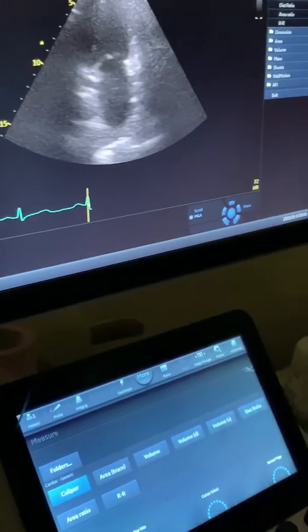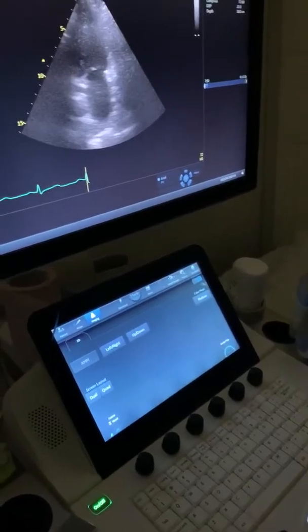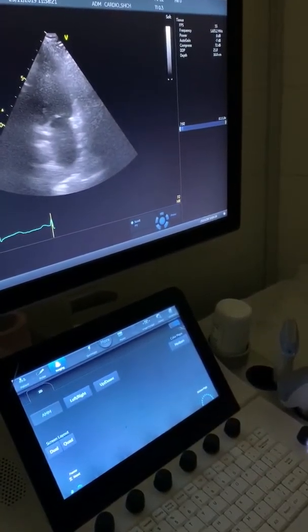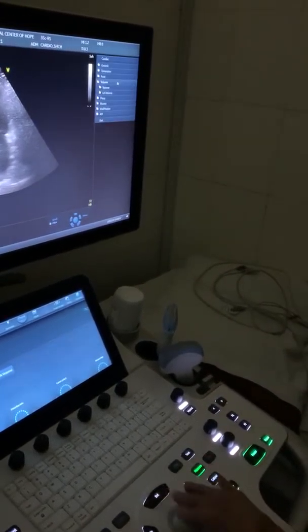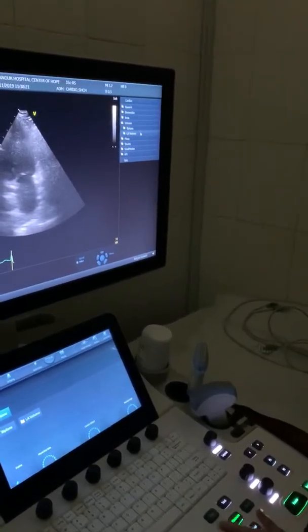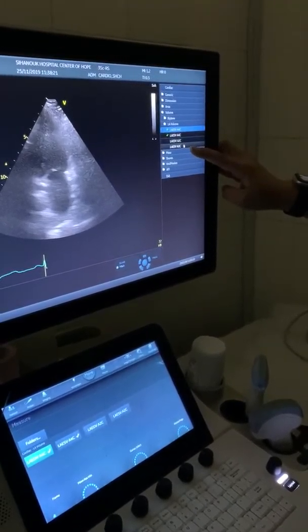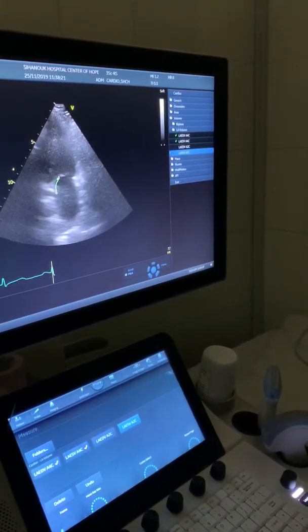I see. Okay. So now, that is the 4 chamber. Yes, this is the 4 chamber. So if you go to the 2 chamber, I think the last one is the 2 chamber. But we need to activate, doctor, the 2 chamber if you want. Yeah, we need to measure. We maybe go tomorrow to config.